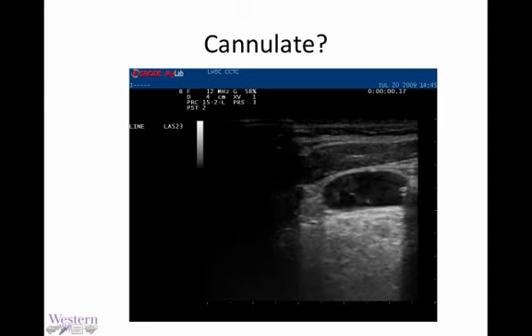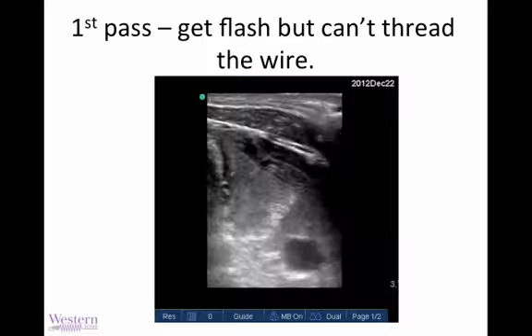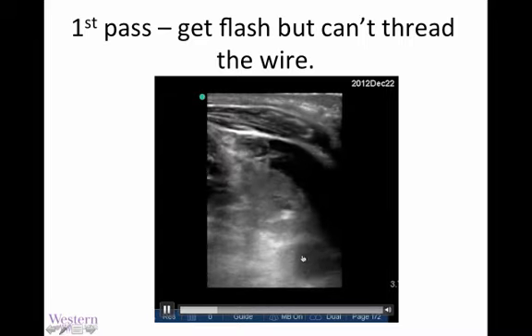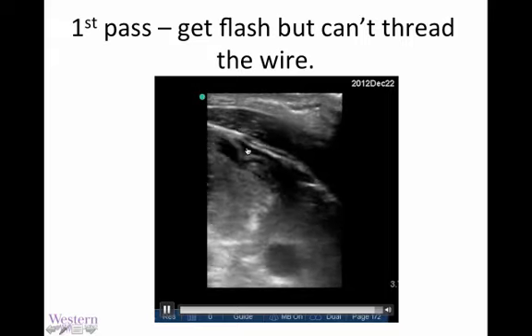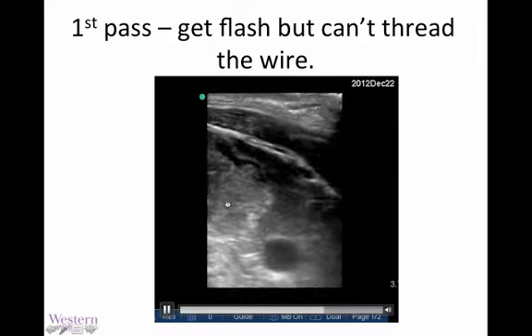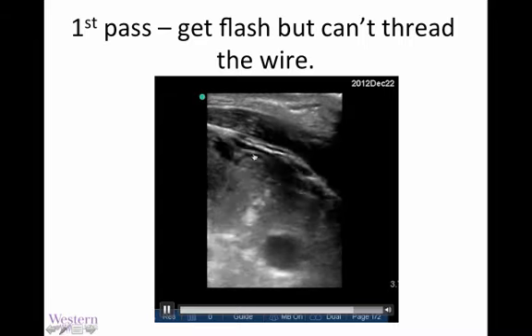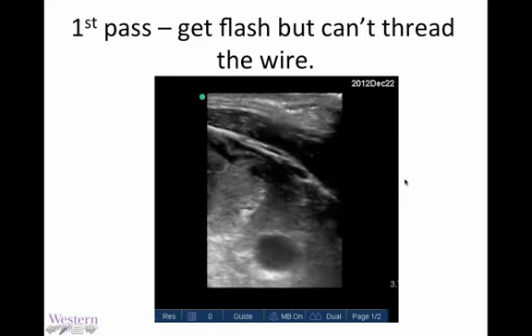Though we don't know the morbidity of cannulating at these sites, we expect it doesn't bring good favor to the patients. And this is an interesting case from ED from a few years ago. You can see after first attempt, there's a carotid there, and the IJ is somewhere up here, we believe. I was asked to have a second look at this, and what certainly I was able to deduce was that after an unsuccessful poke, inability to pass the guide wire, there was a massive hematoma here now along the back wall of this IJ that's compressing it and making it very difficult to gain access.